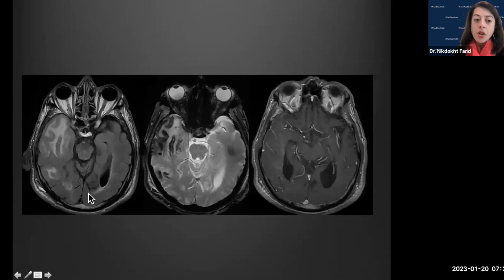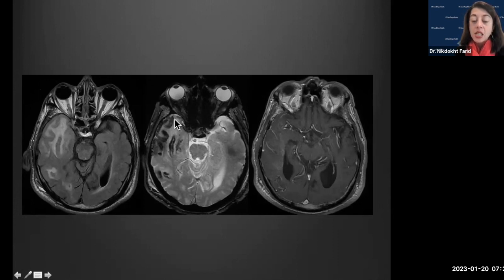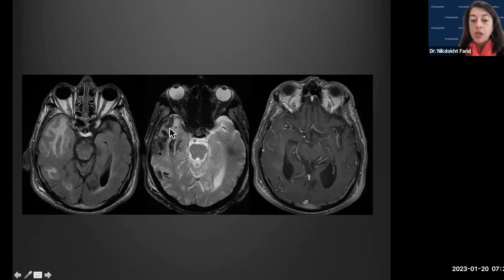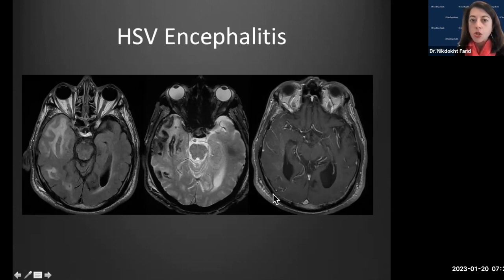If we see a pattern suggestive of HSV encephalitis, even if uncertain, we must bring it up so the patient is worked up and promptly treated with acyclovir. Another example shows HSV encephalitis with involvement of the right temporal lobe — this patient was not treated promptly and developed marked hemorrhagic change, seen as susceptibility on GRE, with some associated enhancement.